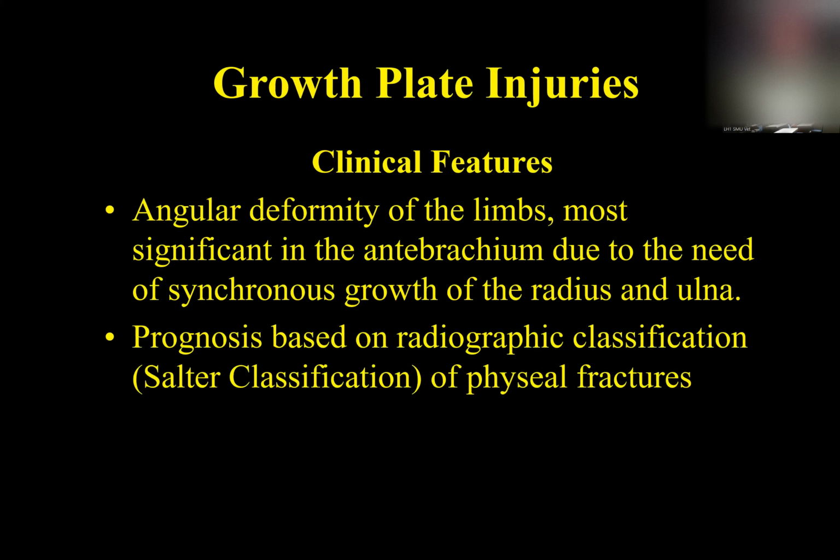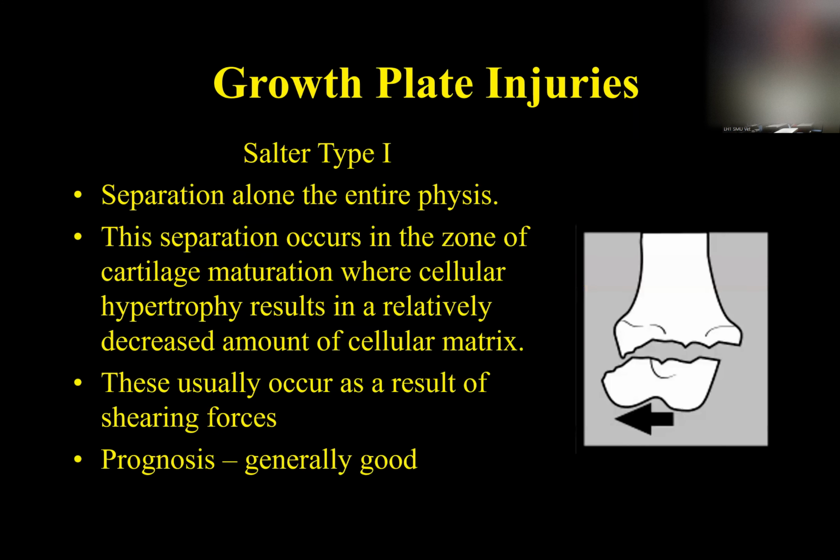If you don't do something about them surgically, a lot of times the animal over time, as it heals, will heal in an abnormal position, resulting in an angular limb deformity. Now, these you need to know too, and there's no easy way to learn these other than you just have to commit them to memory. This classification is called the Salter-Harris classification of growth plate fractures. It comes from human medicine, but people in veterinary medicine use the same thing and it works well.